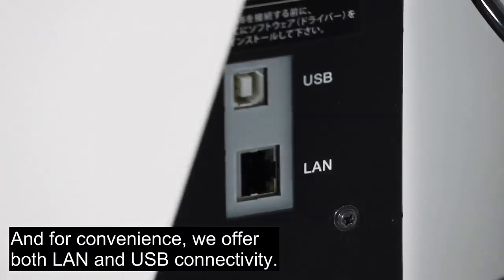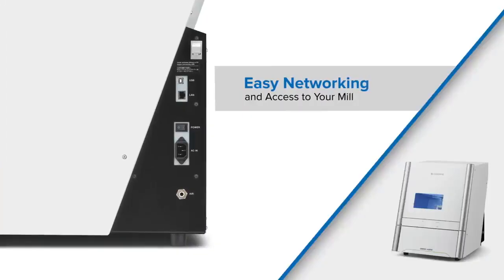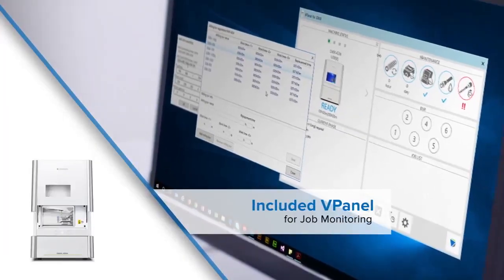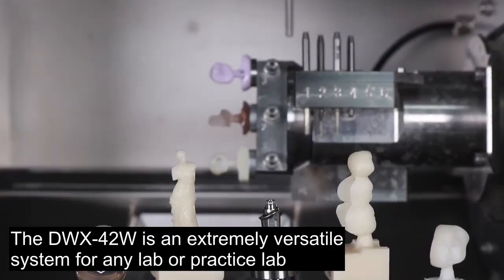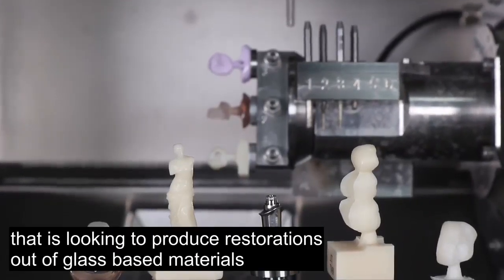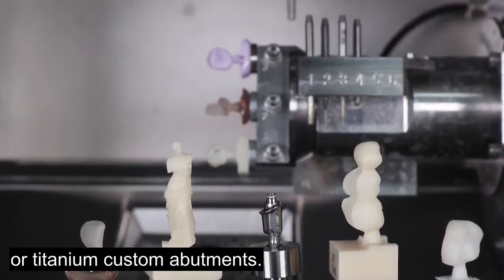For convenience, we offer both LAN and USB connectivity. The DWX42W is an extremely versatile system for any lab or practice lab that's looking to produce restorations out of glass-based materials or titanium custom abutments.